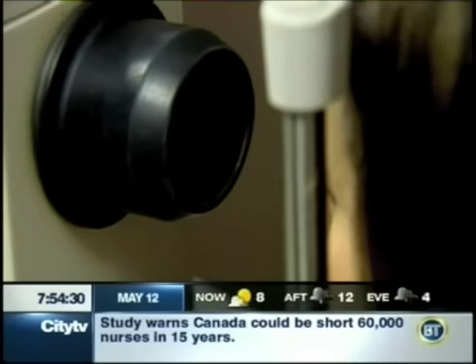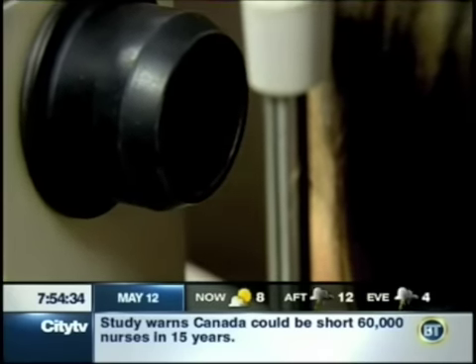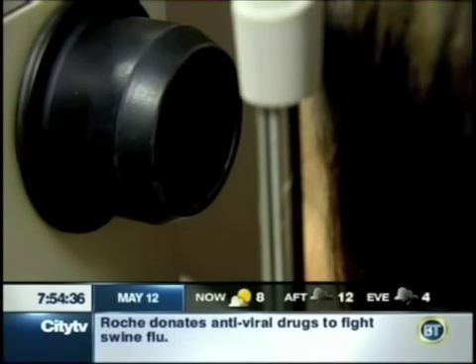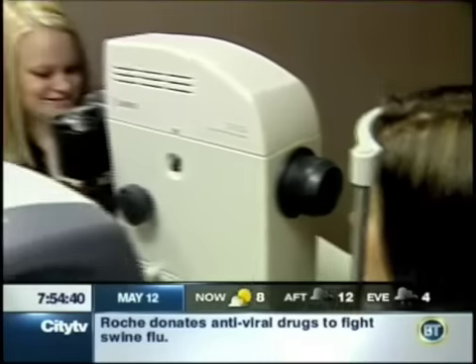Wonderful. No problem. Let's do your left eye next. Same thing. It's my best side. Now the green light's floating over here. Got it. Okay, bright flash. And that's it. You can sit back. That's the easiest photo shoot I've done so far.